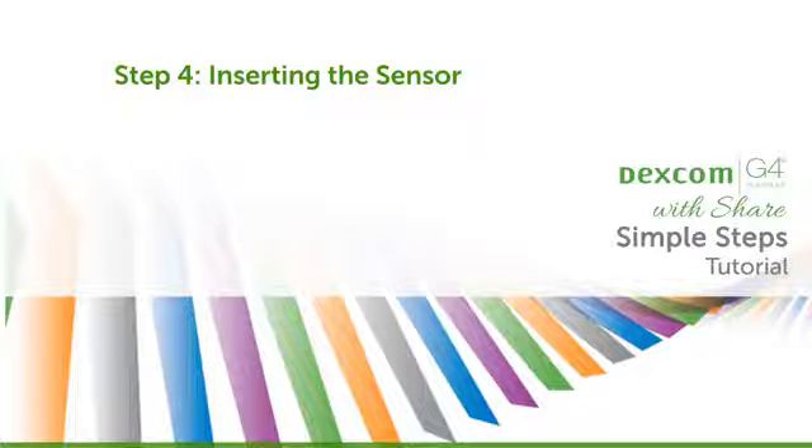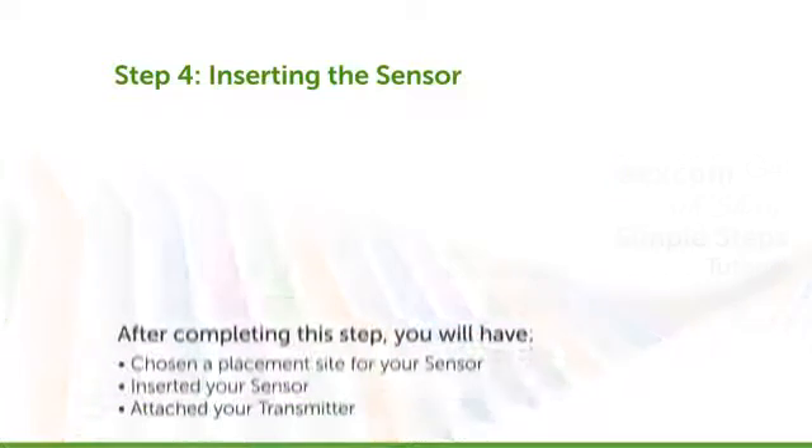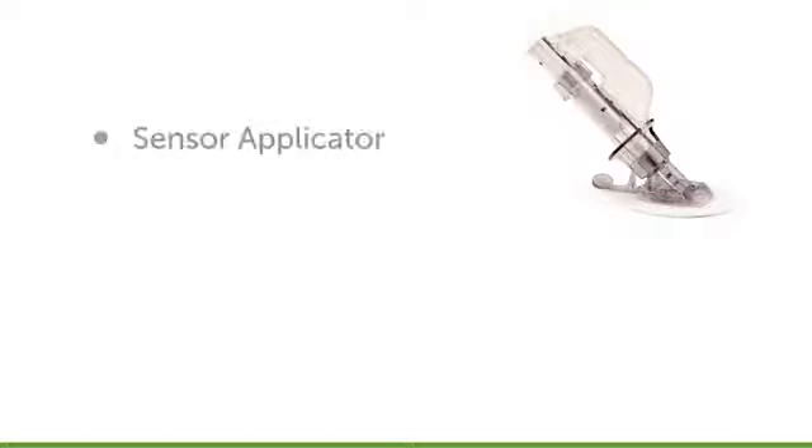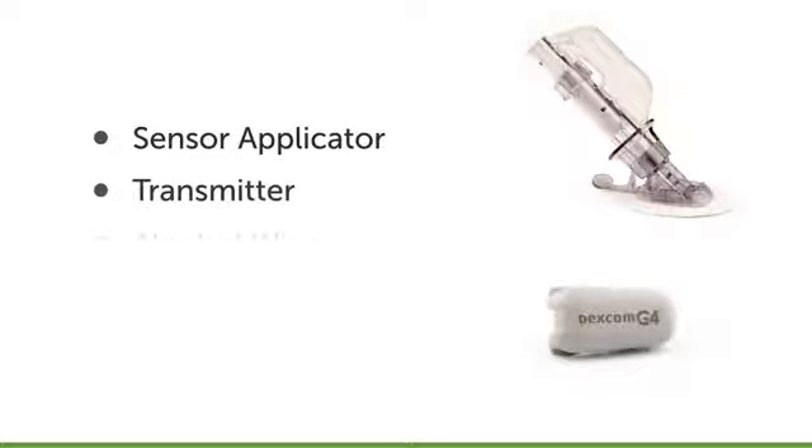Now that your initial setup is done, it's time to learn how to insert a new sensor. After completing this step, you will have chosen a placement site for your sensor, inserted your sensor, and attached your transmitter. Before starting this process, you should have a sensor applicator, your transmitter, and alcohol wipes ready to go.